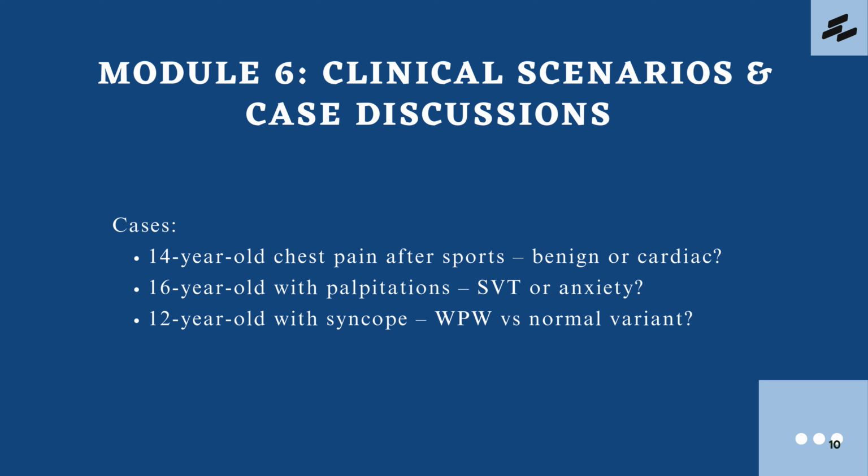Module 6, Clinical Scenarios and Case Discussions. Now we'll bring everything together with real-world cases. Case 1. A 14-year-old with chest pain after sport. How do we decide if it's benign or cardiac? Case 2. A 16-year-old with palpitations. How do we differentiate SVT from anxiety? Case 3. A 12-year-old with syncope. Could this be Wolff-Parkinson-White or just a normal variant? By working through these scenarios, you'll apply structured workflows and know when to escalate.